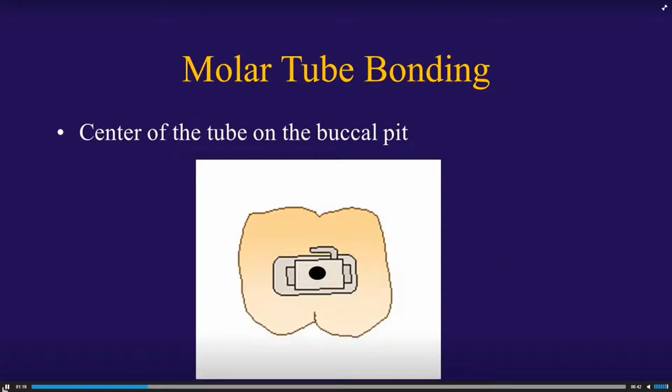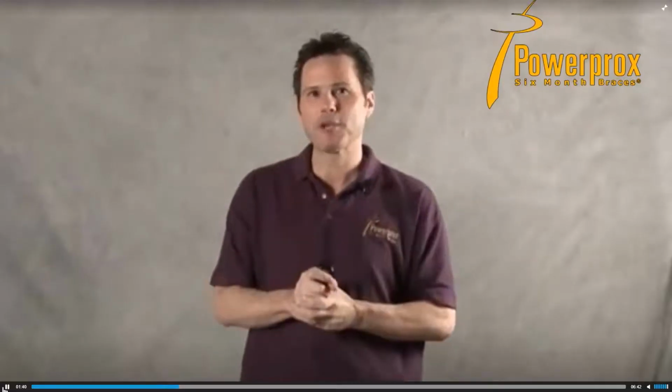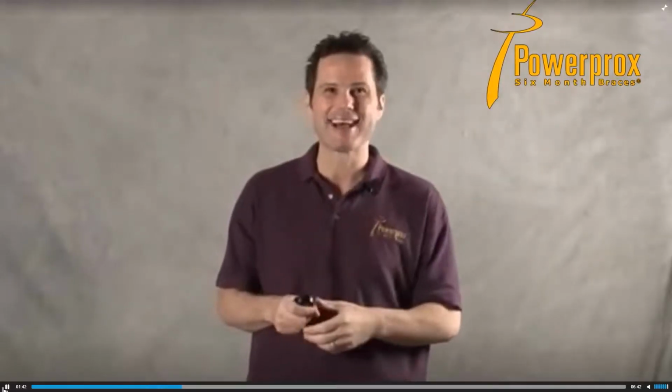Now, the molar tube doesn't have an open face slot. It's a tube, okay? So you can't get the height gauge in there. Also, the cheek's going to be in the way. It would be very difficult to position that bracket height gauge anyway. So what we do is we place the center of that tube right on that buccal pit, right in that buccal groove. That's going to get you where you want to go 99% of the time.